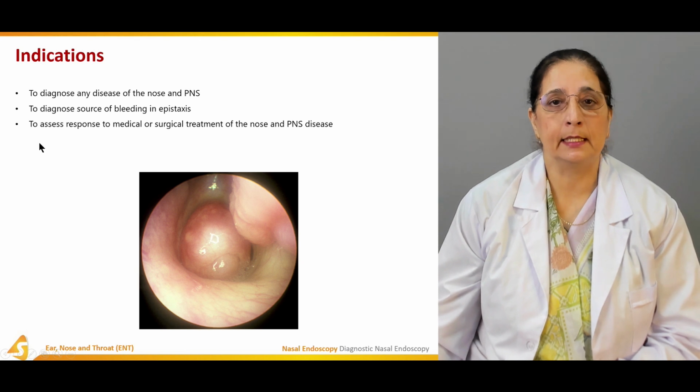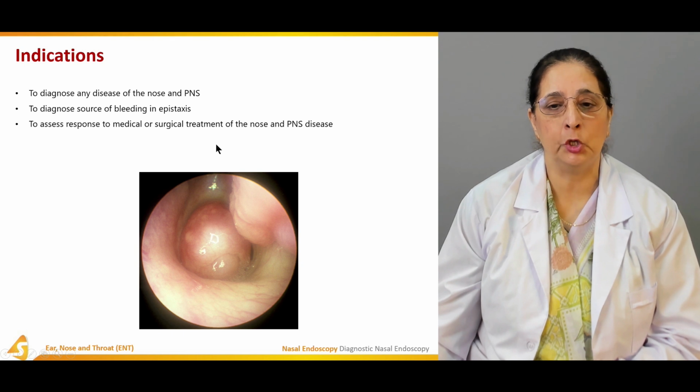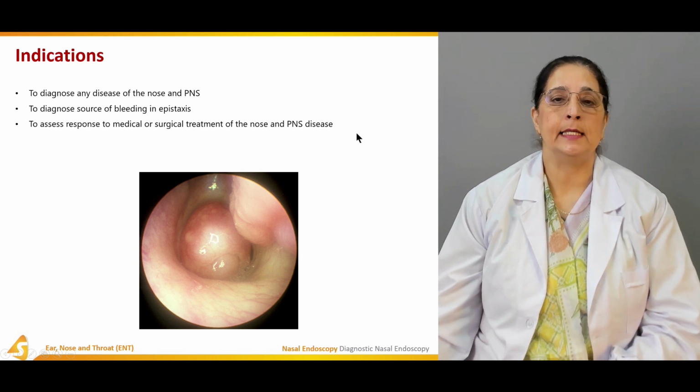Another indication is to assess the response to medical or surgical treatment of nose and paranasal sinus disease.